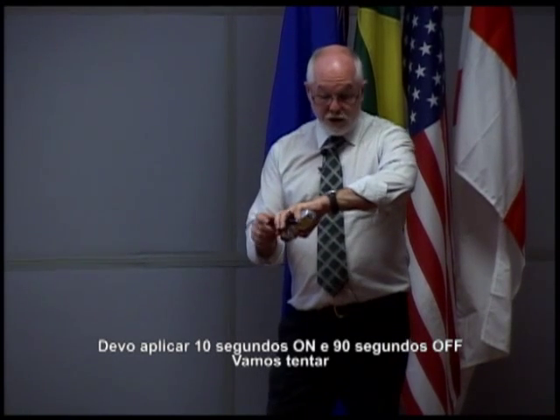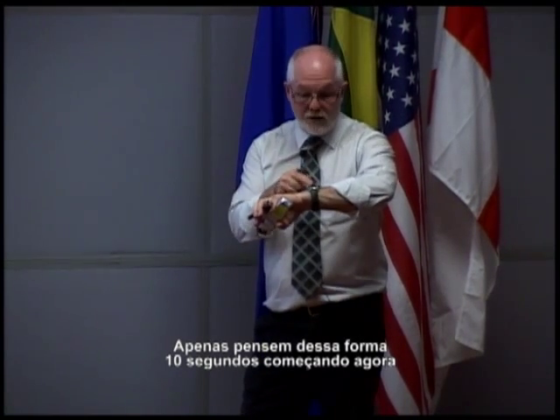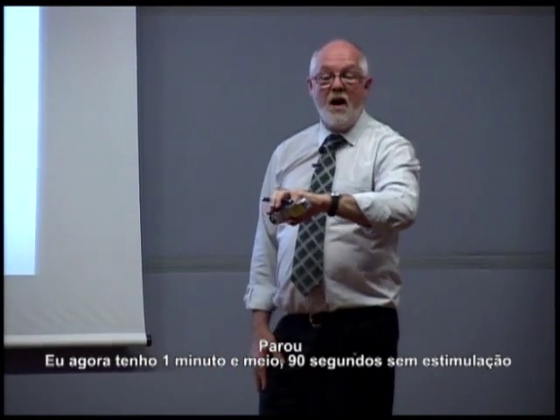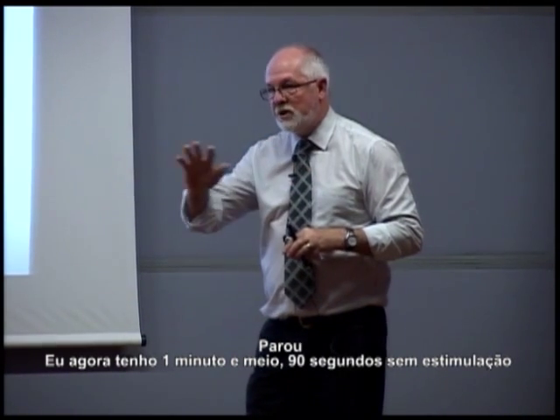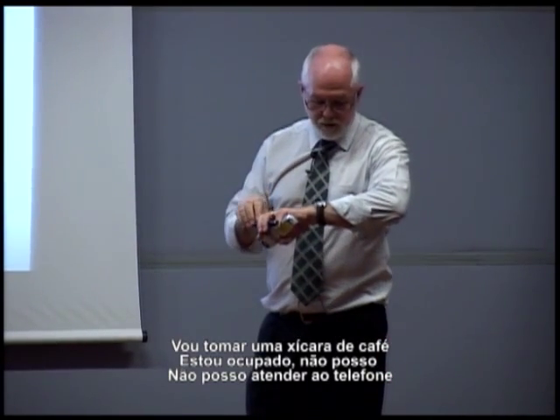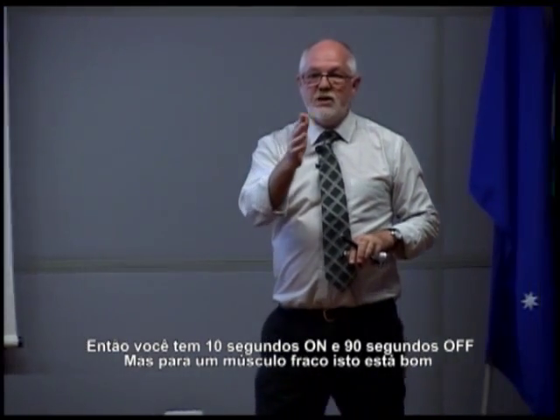All right? So let's just try, because if you just think about this, 10 seconds on, it's coming on now. So that's 1, 2, 3, 4, 5, 6, 7, 8, 9, it's still on. 10, stop. I've now got 1.5 minutes, 90 seconds of no stimulation. I'll have a cup of coffee. All right? I'm busy. I can't take the call. So you have 10 seconds on, 90 seconds off.